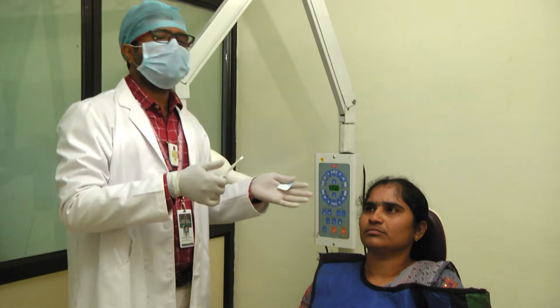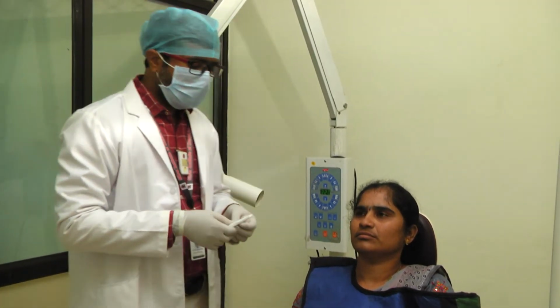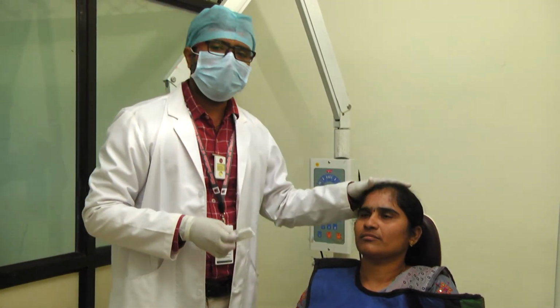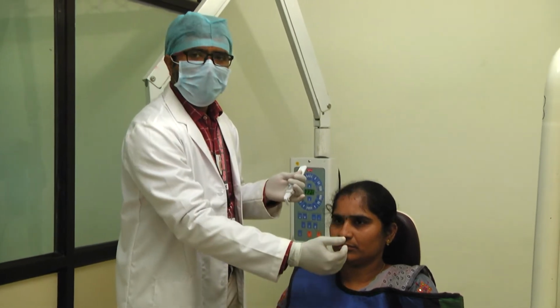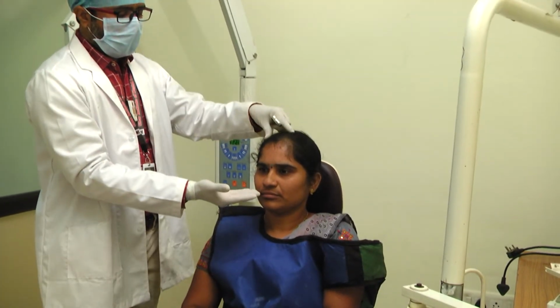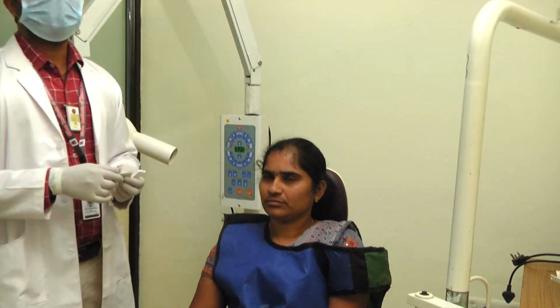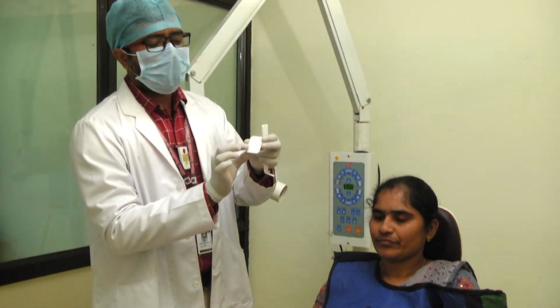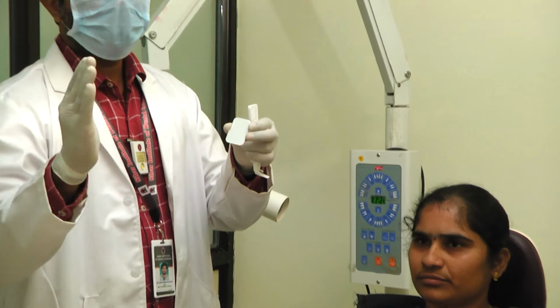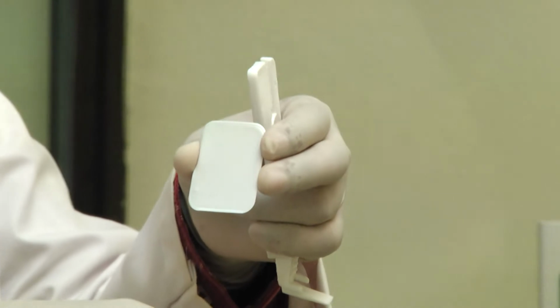Now let us discuss the different intraoral projections of different teeth. Always for the maxillary teeth, as I said, the patient position should be such that the mid-sagittal plane is vertical and the occlusal plane should be horizontal. And while making the film for the maxillary central incisors, always, as I said, the raised dot or knob is towards your exposure side and towards the incisal surfaces. So this is how you have to place the film.